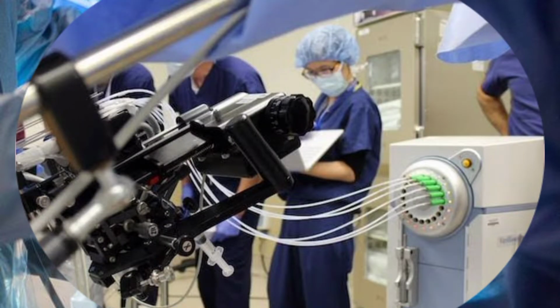This type of radiation is faster and more effective than conventional radiation for some types of cancer. This can be performed on an outpatient basis and may produce fewer side effects. What can HDR brachytherapy accomplish?